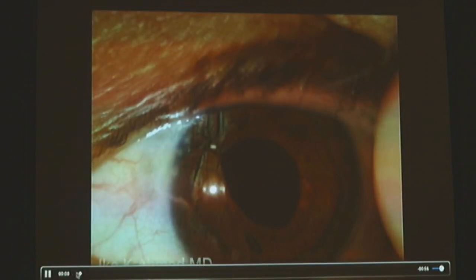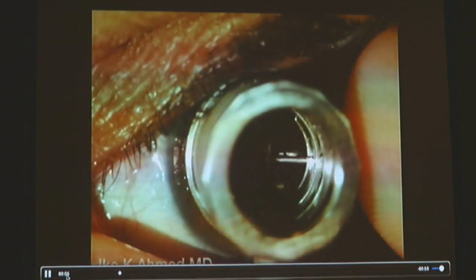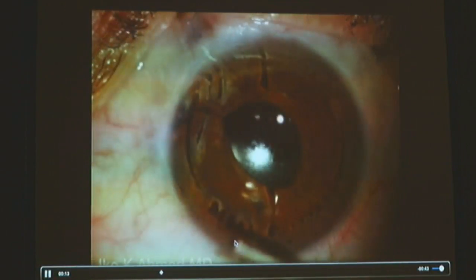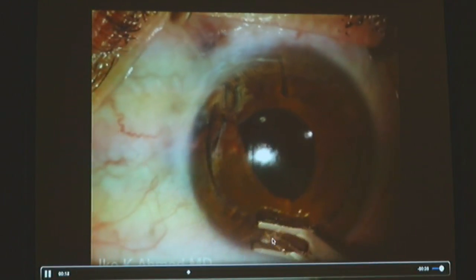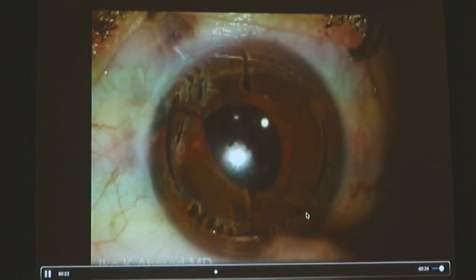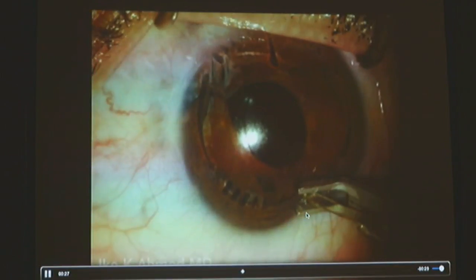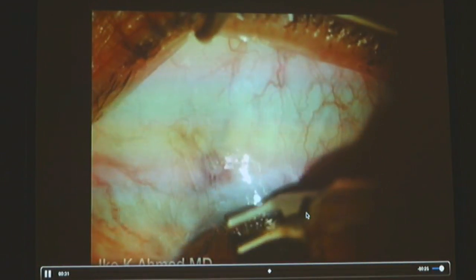And here you see the marker being placed on the eye. This patient here, you can imagine, probably has some with-the-rule cylinder, you'll see. And there's the mark. Each mark here gives us about 15 degrees, 30, 45, 60, depending how much we want. We then follow the mark. The treatment zone is about 10 millimeters. And it's a very simple thing to do. Now LRIs are basically quite a bit of art, maybe less science. I typically treat conservatively, and we can, of course, treat more as we have to do this.